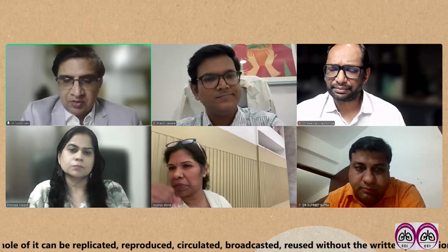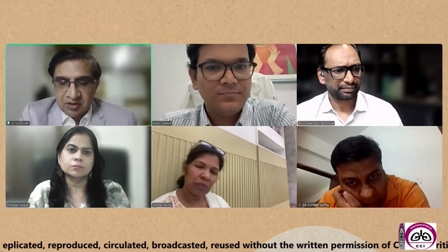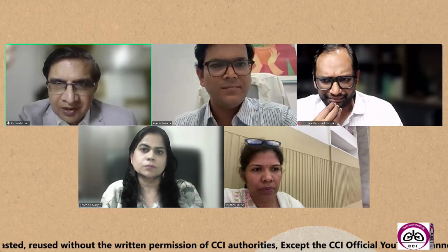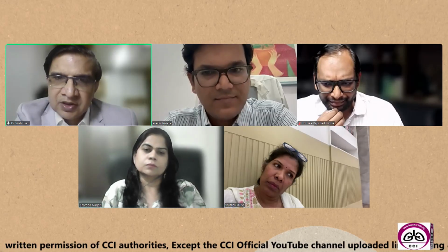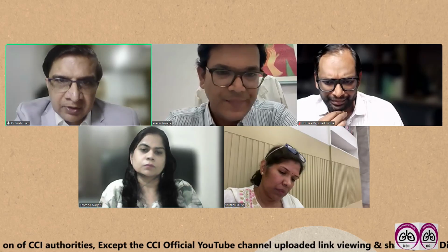The next question is to Dr. Pravin. Dr. Pravin, how many needle passes are recommended per node in different clinical situations, suspected lymphomas, malignancies, sarcoid and TB? What are the recommendations? Because the beginners need to understand how many passes they should take, and in which situations they are supposed to take more passes than the 3 which we normally recommend, 3 to 4.